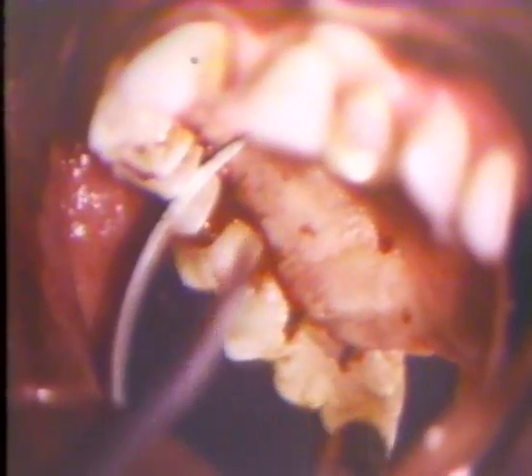The periosteal elevator is used to reflect a full-thickness palatal flap and enables the clinician to gain access to the underlying bony deformities. Tissue has been reflected. The pattern of the osseous defect is easily seen.